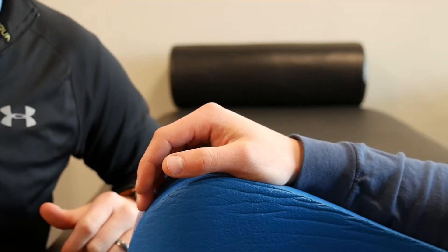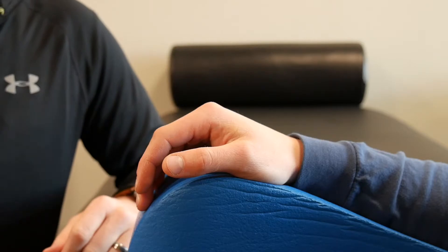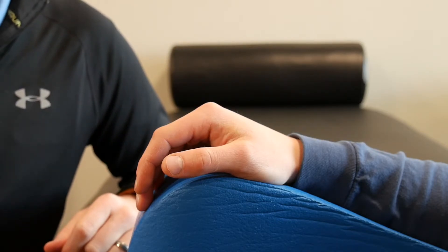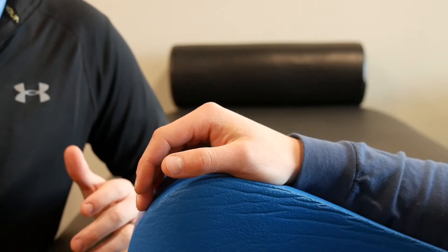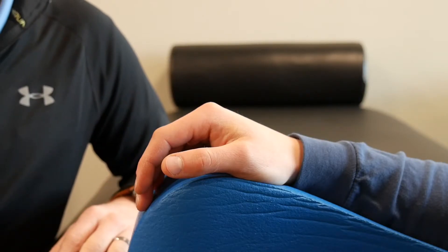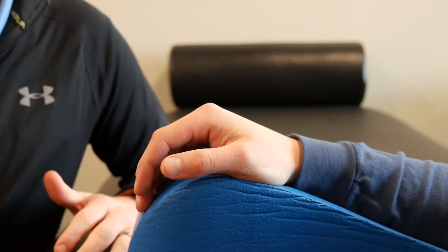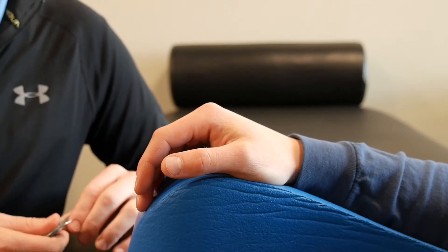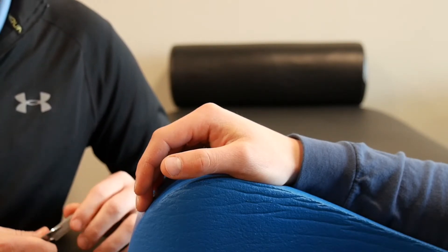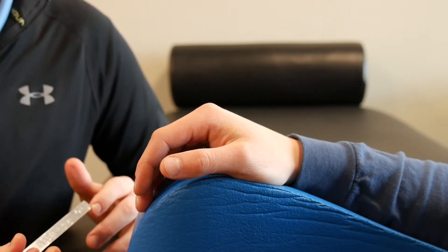Now that we've covered all of the flexion measurements of the finger, we're going to talk about extension. For extension, I would say probably 90% of the time my extension measurement of a digit is going to be from the PIP joint — that's the one you're most likely to see a contracture at. But there are times you're going to need to measure the MCP and DIP joint extension as well.